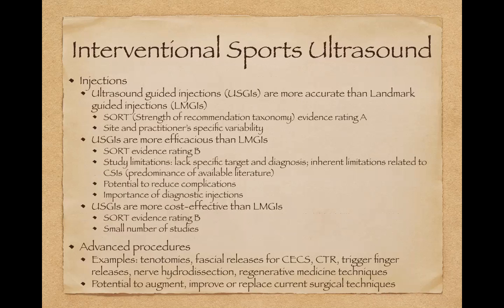So, interventional sports ultrasound. For injections, ultrasound-guided injections are more accurate than landmark-guided injections, and that SORT evidence rating is an A. And like we said previously, it may be site and practitioner specific. Then ultrasound-guided injections are more efficacious than landmark-guided injections. That SORT rating is a B.